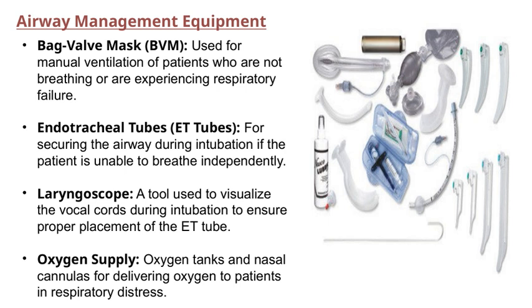Finally, we can't forget about the oxygen supply. Whether it's oxygen tanks or nasal cannulas, these are what allow us to deliver supplemental oxygen to patients in respiratory distress. Providing adequate oxygenation is often the first step in stabilizing a patient and preventing further deterioration.